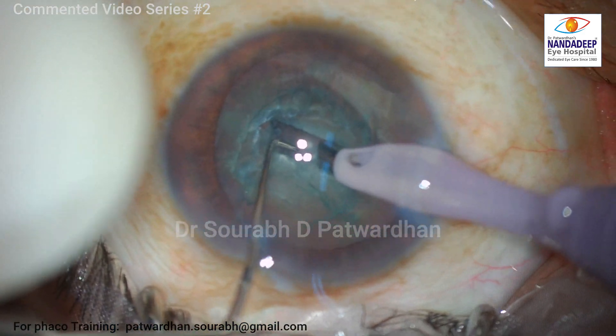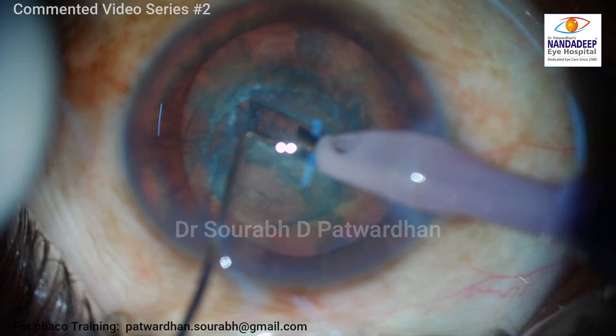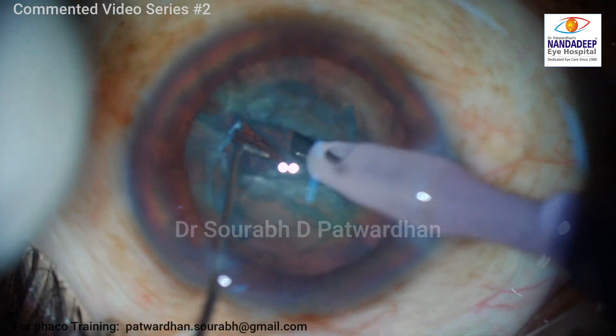I am going here very carefully for trenching, because I know it is not going to be the routine depth I'm used to. Just a couple of trenches and you can see that I have reached the posterior plate already.